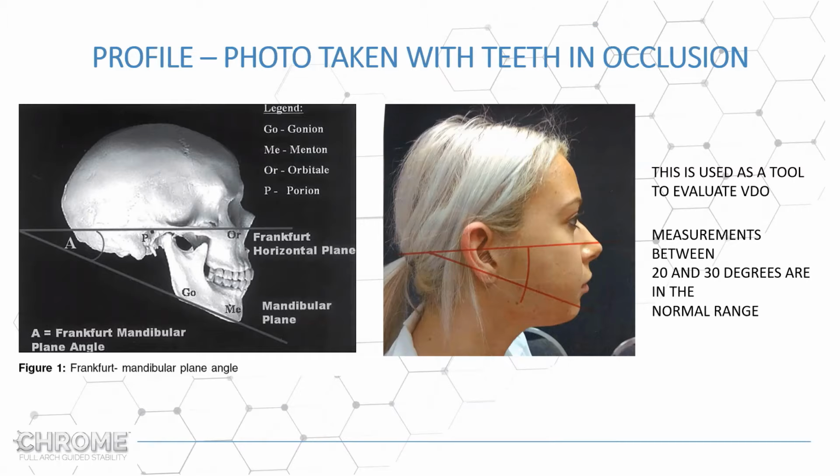Now, we're not dogmatic about any of this with the doctors. We recognize cases that could have their vertical opened. We make the doctor aware of it with scientific measurements and photographs, and they ultimately decide what to do. If they don't want to open the vertical, they could run into plane of occlusion problems. They could run into situations where there's not enough restorative space, or we have to use shorter implants, different things that could happen during planning that would prevent the optimum result for a patient.